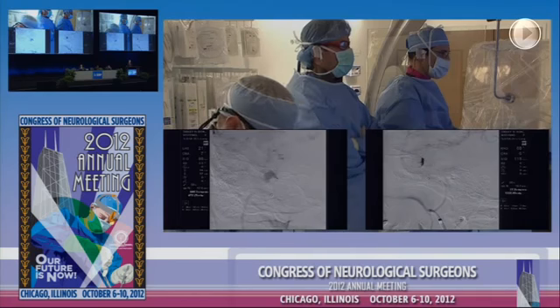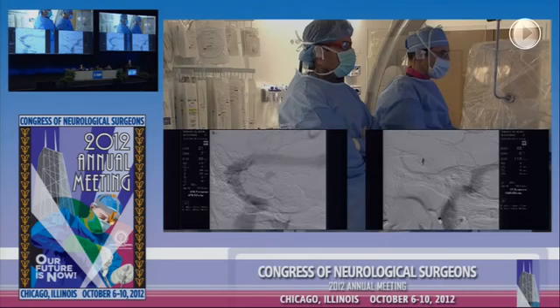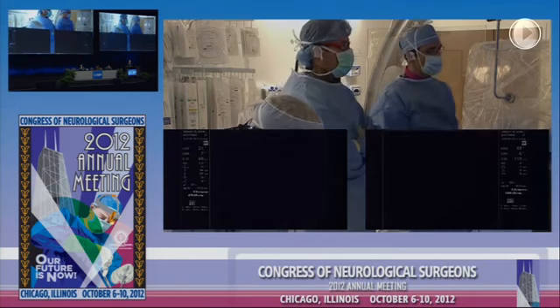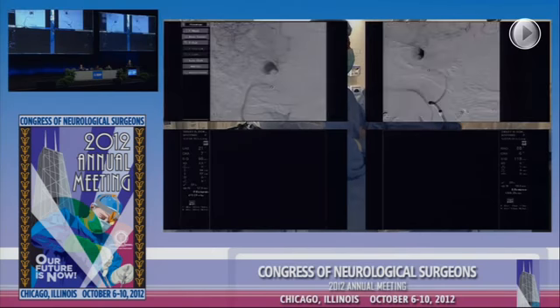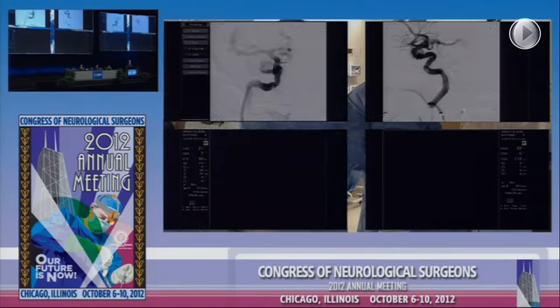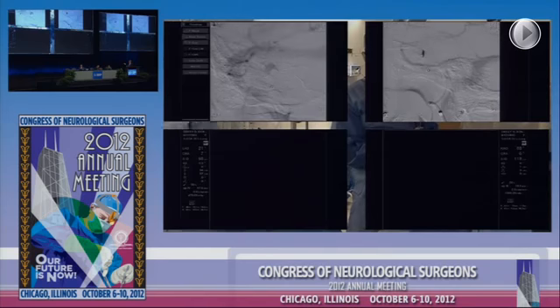On that left-hand view, you can see the outline of the stent and the stasis that exists. I mean, there's still stasis there now. So the outflow of this aneurysm has been severely impeded. There's already thrombosis occurring in this part of the aneurysm. There's significant change in flow. So I think for today, this aneurysm is done. And maybe in the last 18 minutes, we can go into the second room.